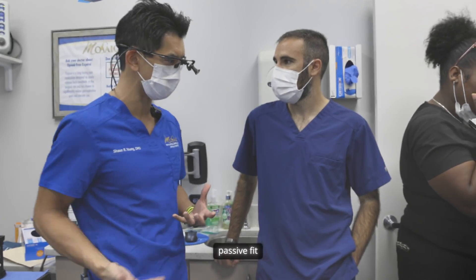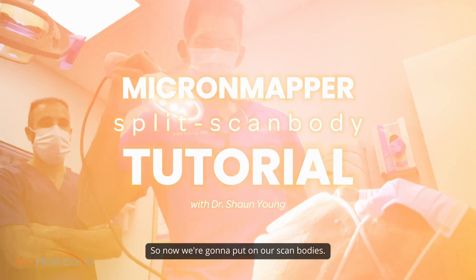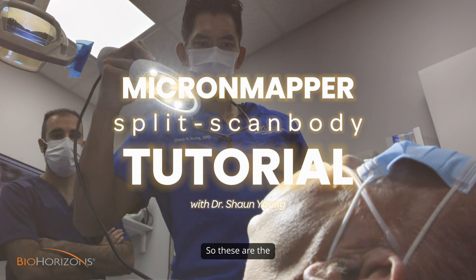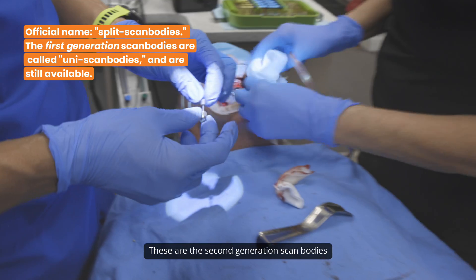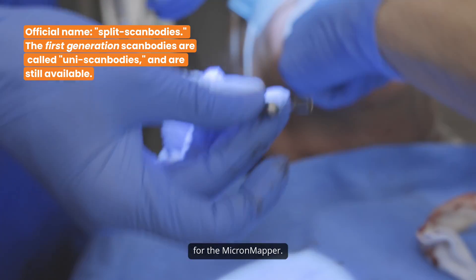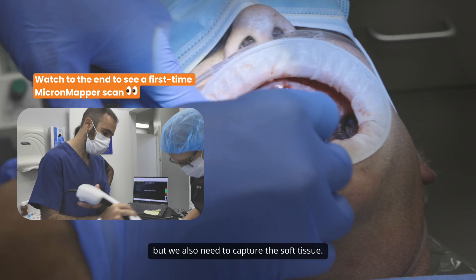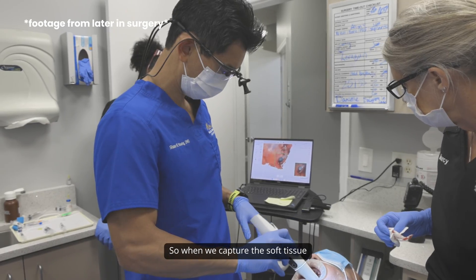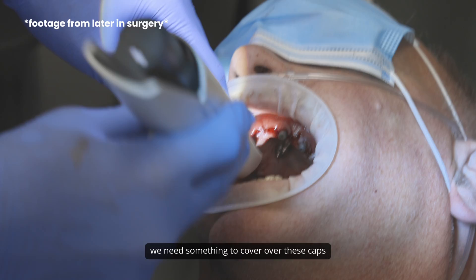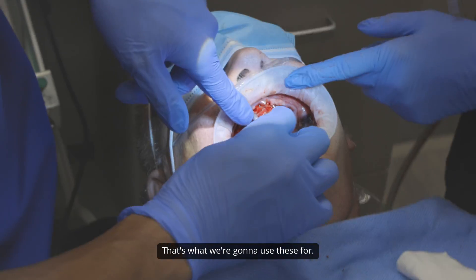This is going to ensure that we have a passive fit when we put the temporary in. So now we're going to put on our scan bodies. These are what we call the dual-purpose scan bodies — the second-generation scan bodies for the Micron Mapper. We need to capture the position of the implants, but we also need to capture the soft tissue. So we need something to cover over these caps in order to capture the tissue adequately, and that's what we're going to use these for.